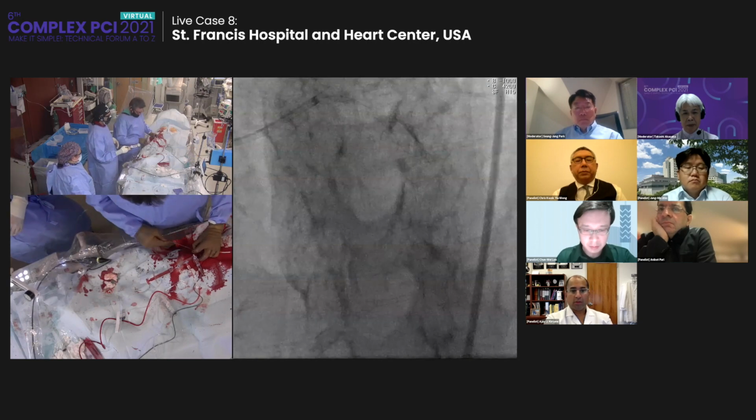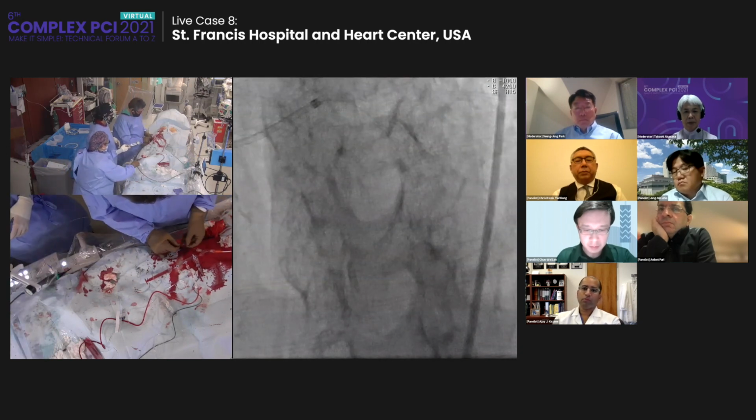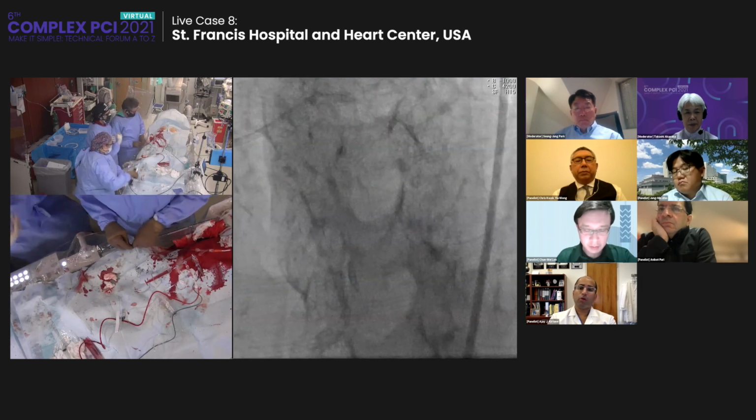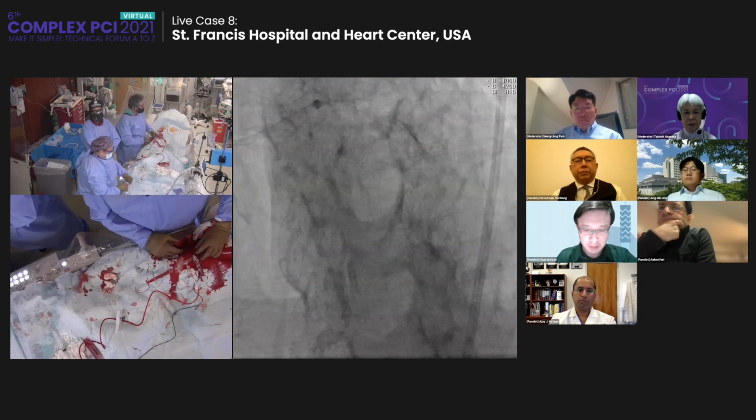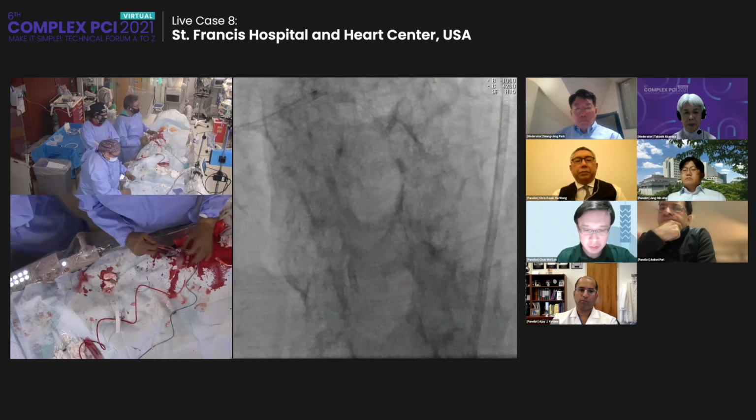Ajay, your question was about, do we use an NC balloon? Well, certainly you don't get any more atmospheric pressure. I think if you image and you see the fractures, you don't have to, but maybe if you're not going to image, you want to see the balloon yielding.